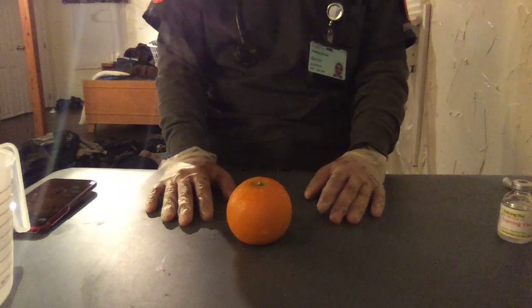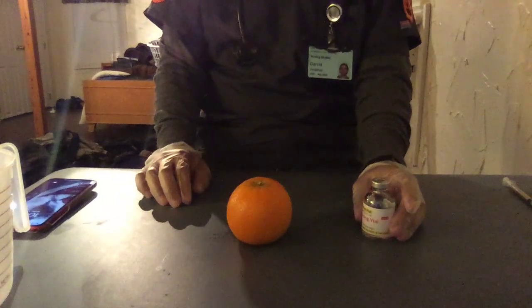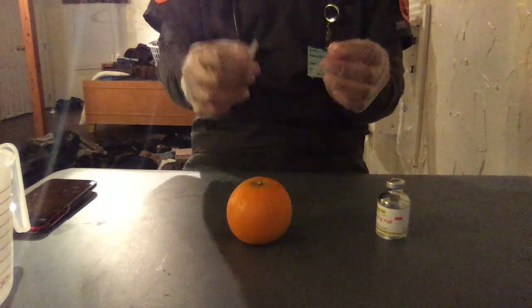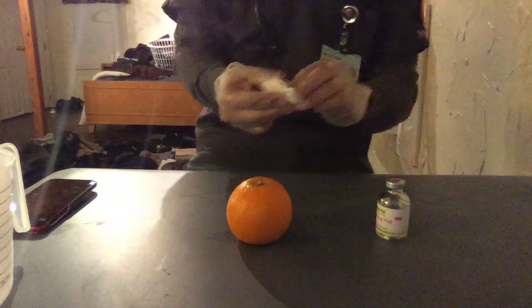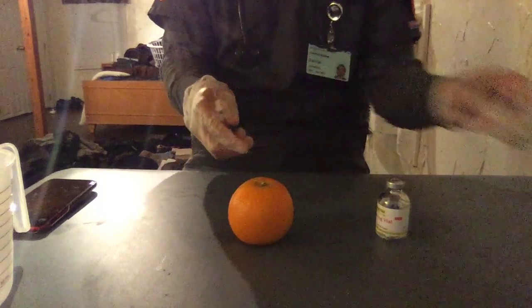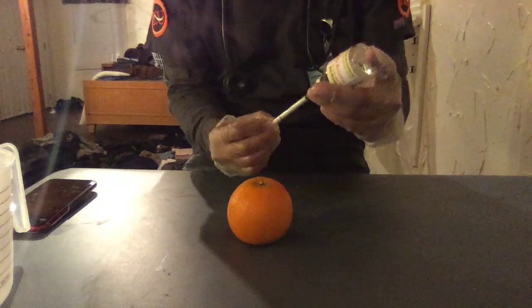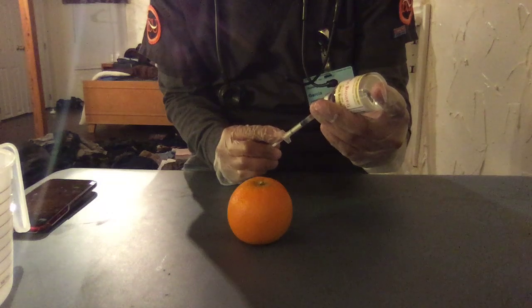Again, I already verified my medication, 0.5 milliliters of saline to be administered subq 1 time now. All right, so I have my syringe and my needle, correct length and gauge. Again, I will go 2 inches away from the umbilical area. I will clean, wipe. I will make sure that I have my vial ready, and then I'll do the same thing. I will do 0.5 this time, just to make sure I don't have any air bubbles. I will not have to aspirate this time.